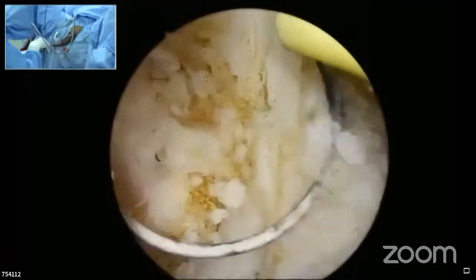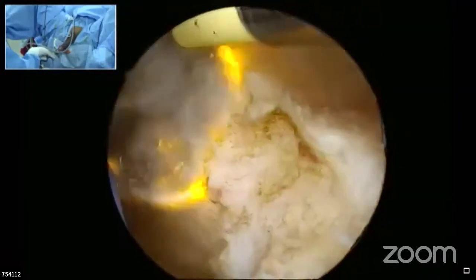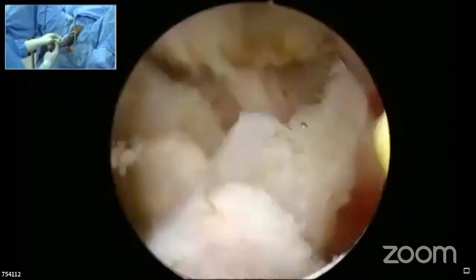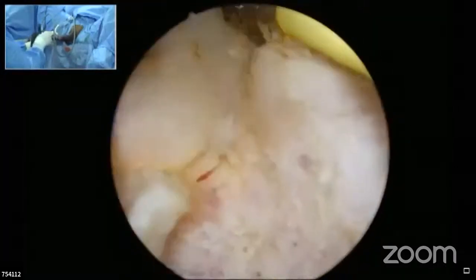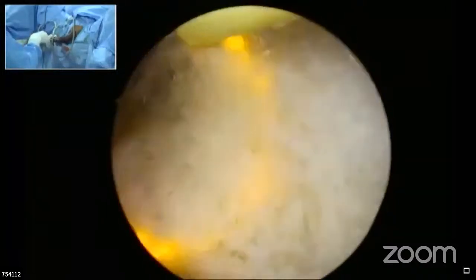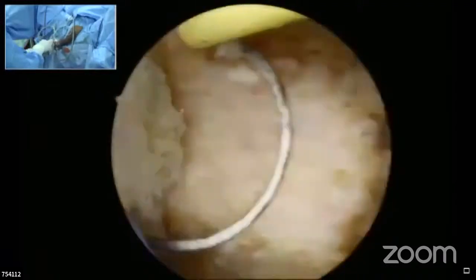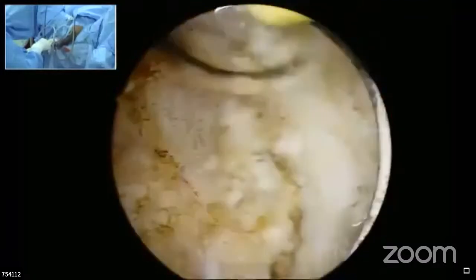Well, that's exactly it. Jokes apart, the point which we were talking about is that movement of the scope is better as a rotational movement, like what Taif has just shown. A rotational movement is safer to the urethra than a movement inside and outside. As far as possible, you need to restrain the in and out movement and make it a rotational movement. Rotational movement is safer, not the inside-out movement of the resector scope.